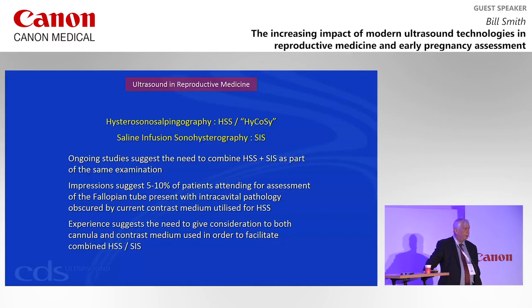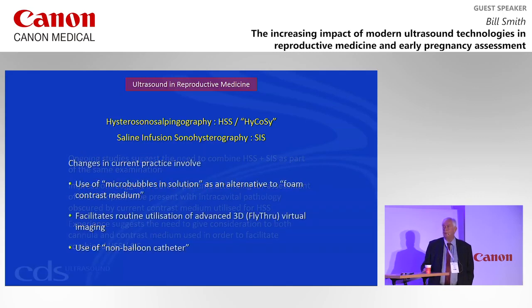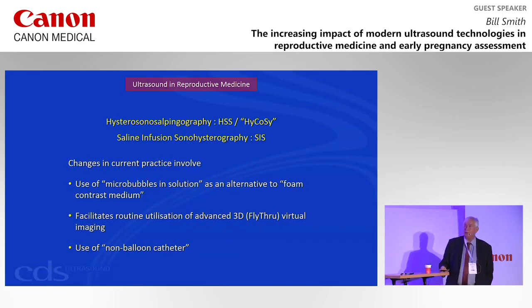Now, we're moving on to kind of checking the tubes, and really, if you're checking the tubes, then you should also be looking at the cavity as well. And I just got a wink from Petra.